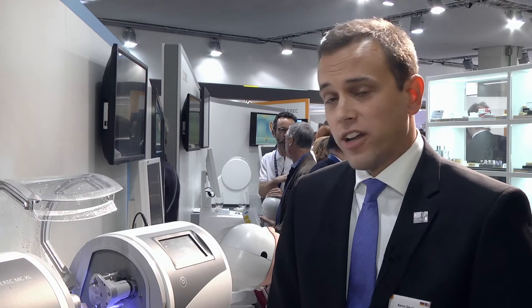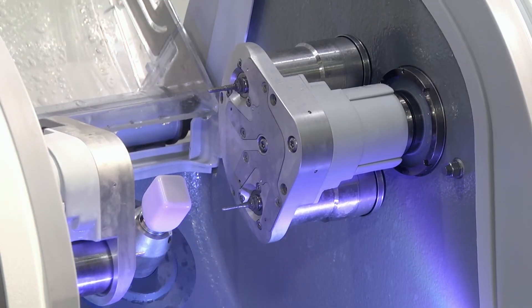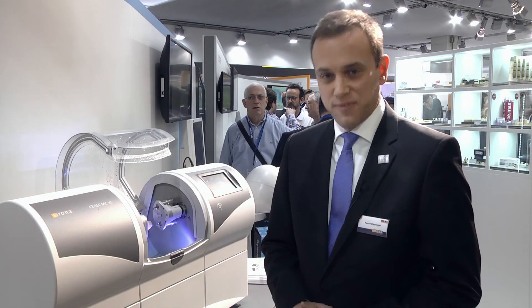So with the Extra Fine Grinding option, the premium package uses all four motors for one restoration — four tools. It does not require a tool changer, so there are no compressed air requirements for the user. Thank you for joining us today to take a look at the new Extra Fine Grinding option. Goodbye.